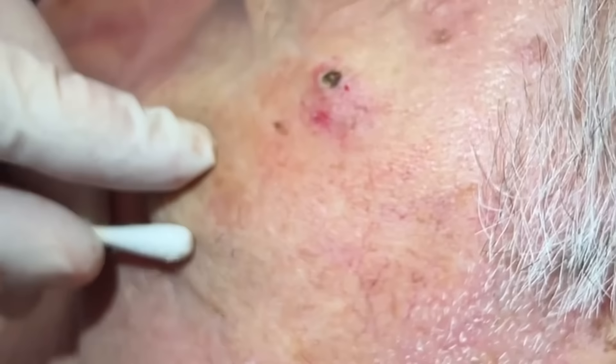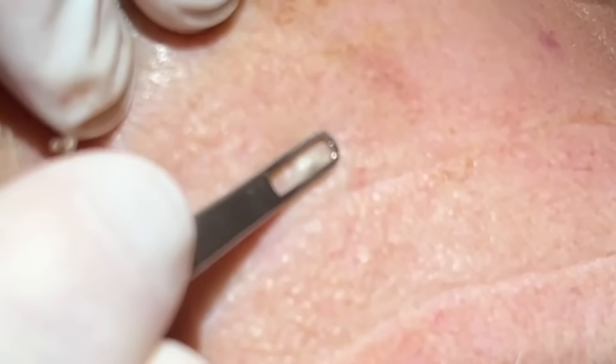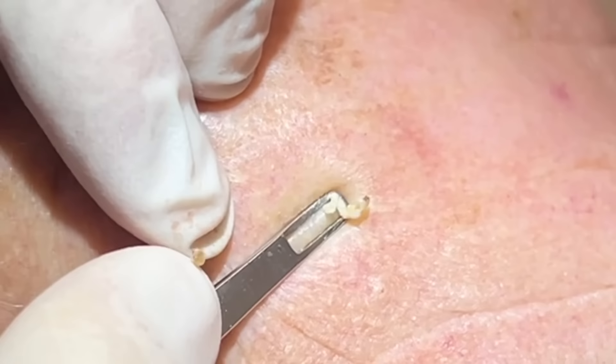Now he's got a couple on the other side. You can come over here. On the forehead I like to use an extractor because we do have something to push against there — the surface bone of the skull. Those can be good. That gives us a lot more focused push right where we need it.